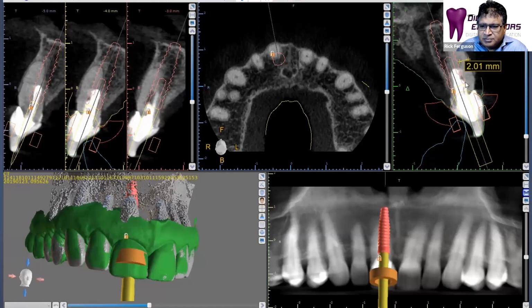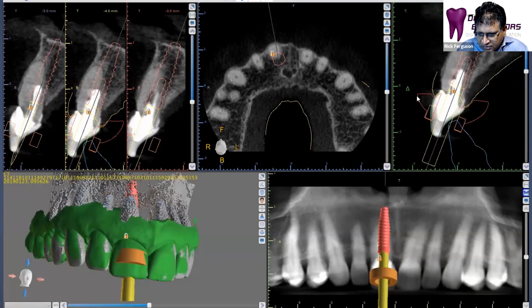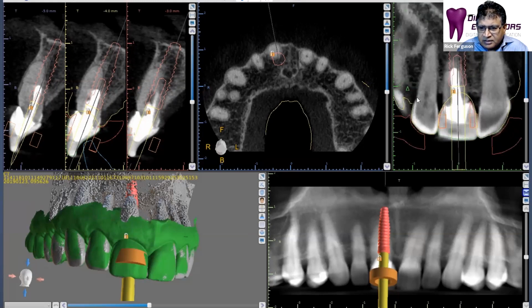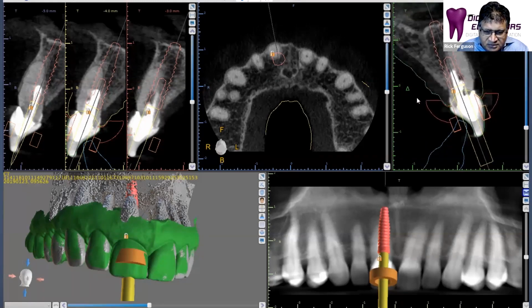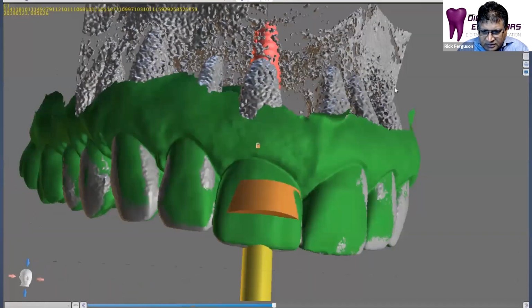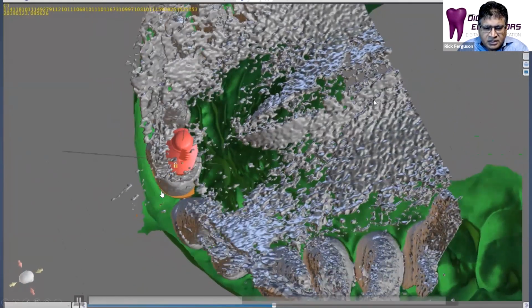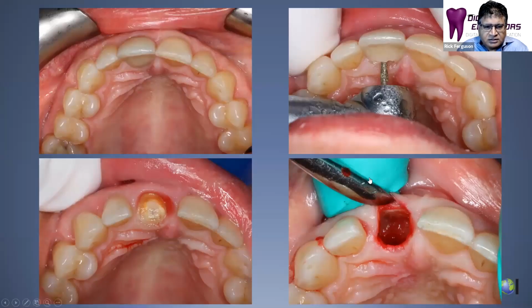So here is the case being planned, making sure that we have the adequate distances and position of the implant, etc. We tend not to keep a high amount of inventory as far as implants in our practice these days, because we're planning out cases digitally, and then we know exactly what to order for the case, plus or minus a few extras. But this is how we're planning out the implant to be placed in relation to the root of the tooth. So here we go now to the surgery. We will section off the tooth, cut out the majority of the bulk of the root, leaving only a sliver of tooth structure in place.